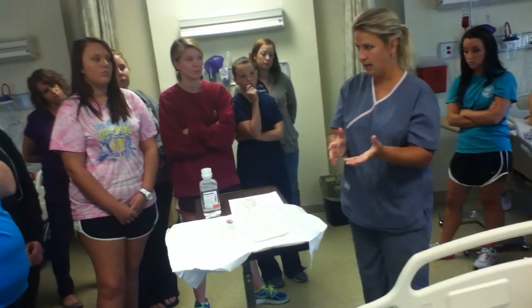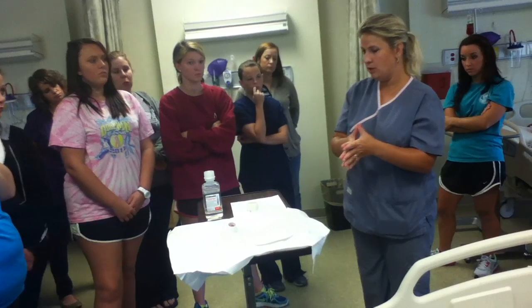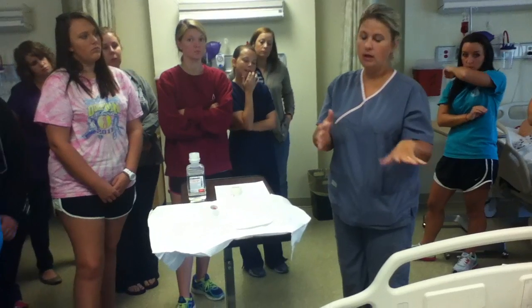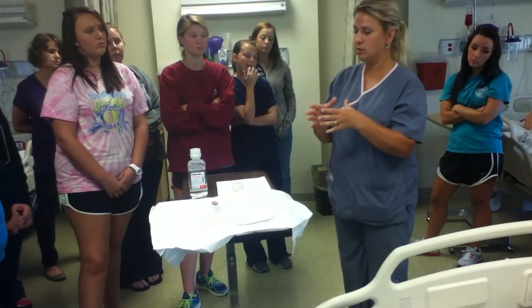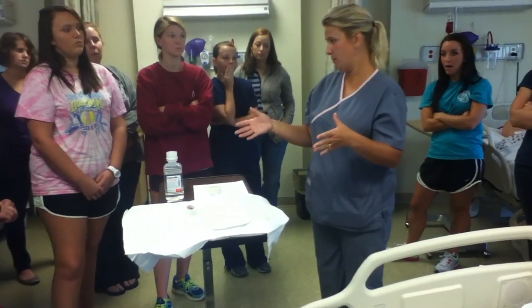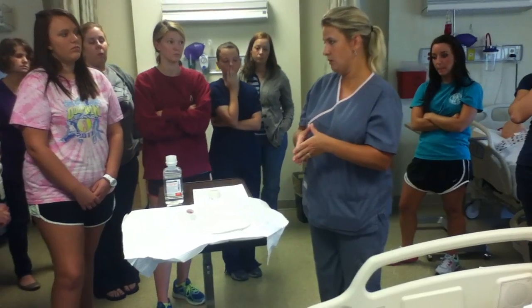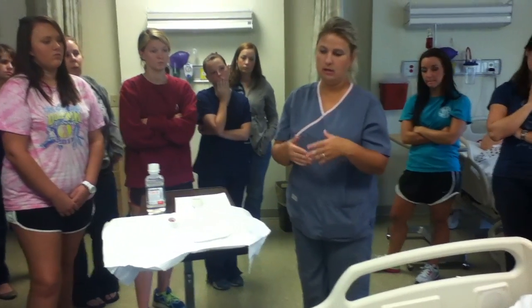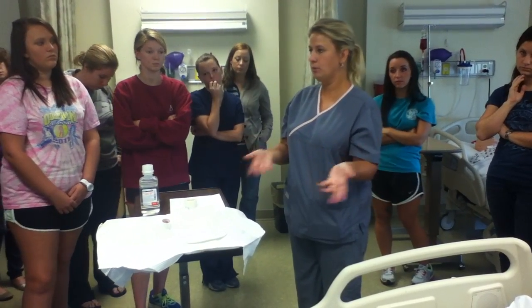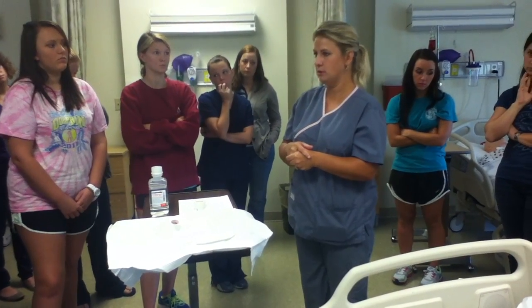ABD pad. You need to describe the wound. My wound was well approximated with a little bit of redness noted, no purulent drainage, no odor. And what's really important, I always like to say that the dressing was performed using sterile technique. Obviously, we all know we're supposed to, but I always like to put that in my charting. And then how did the patient tolerate the procedure? You can say that the patient complained of no pain, patient resting comfortably, and leave it like that. But it's very, very important how your patient actually tolerated the procedure as well.